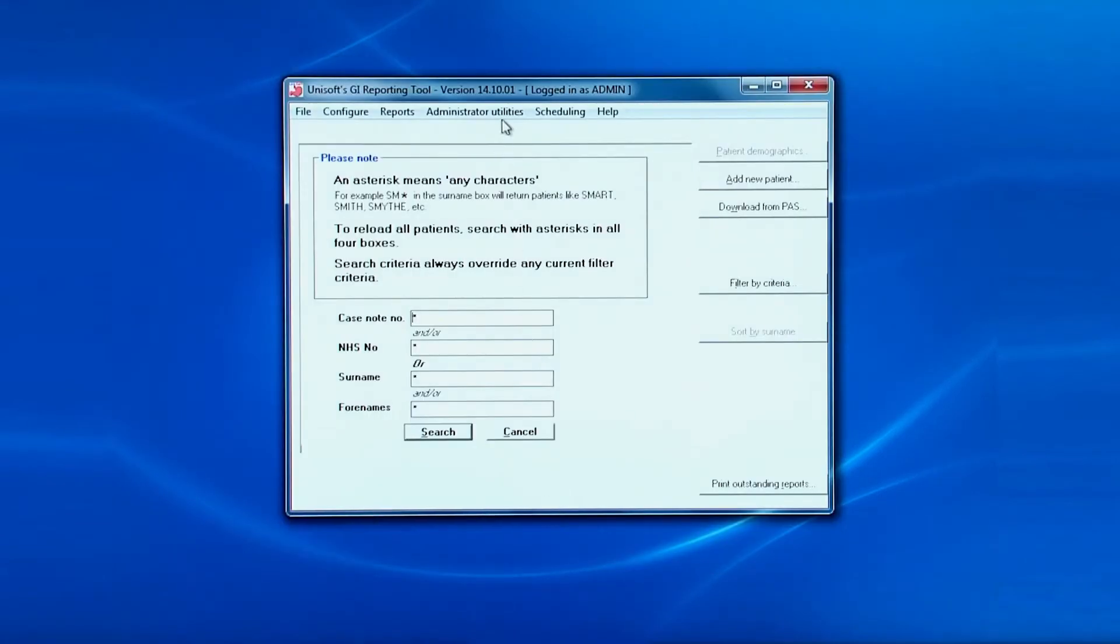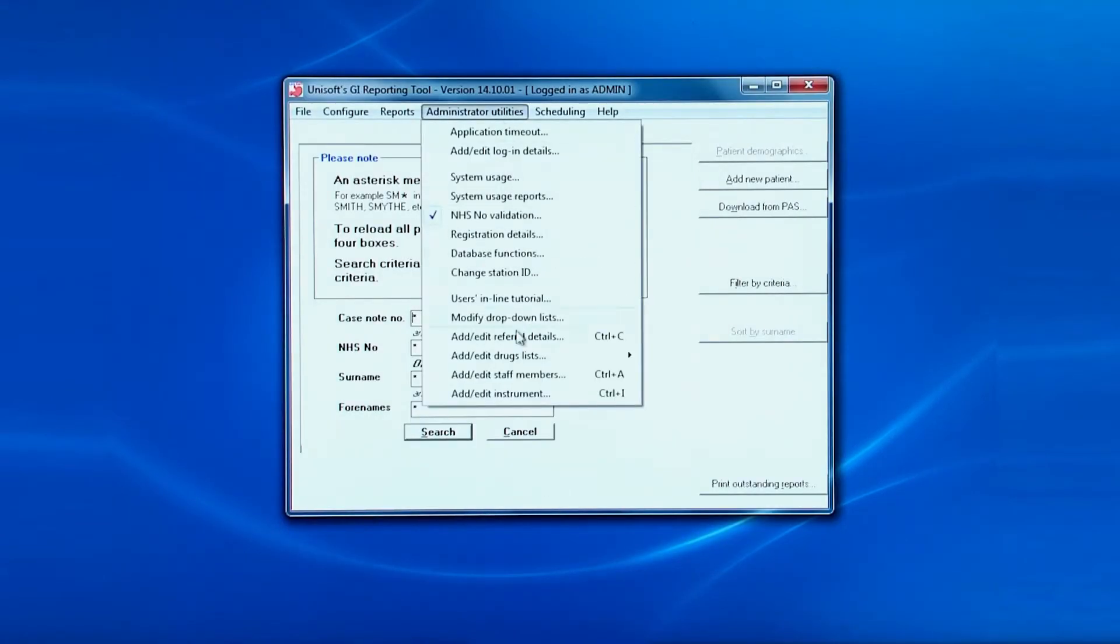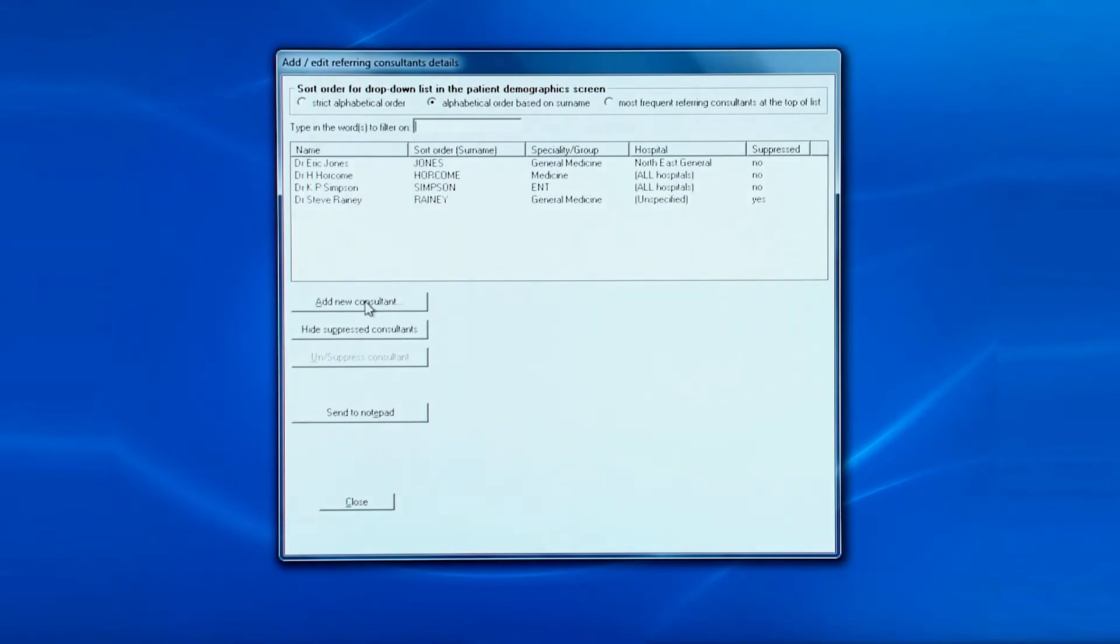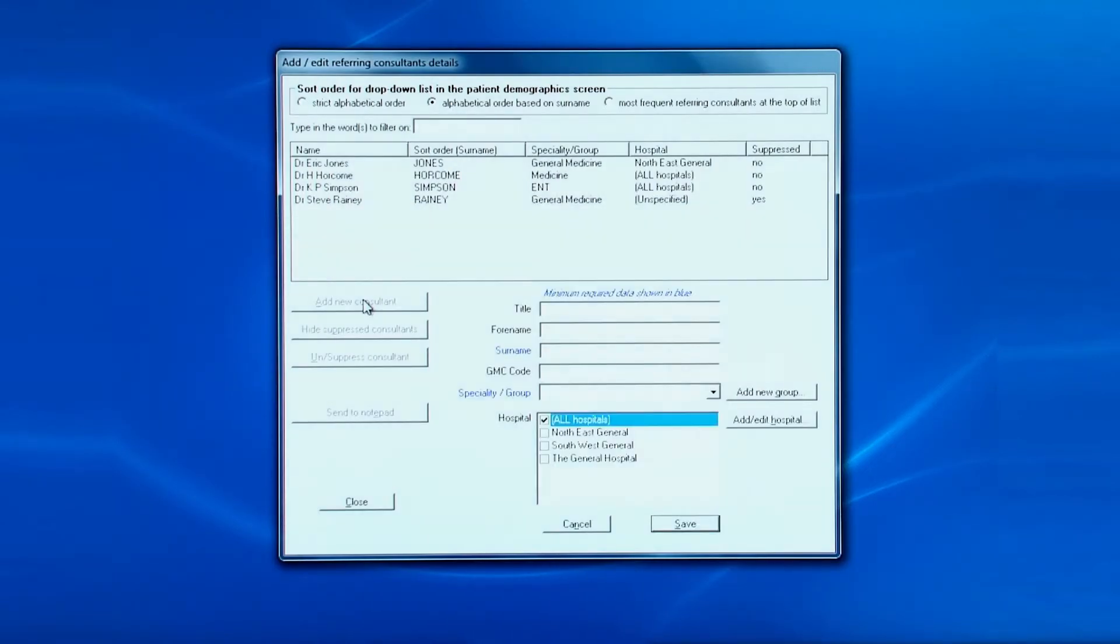If you want to add a generic referring consultant called GP, then this is what you need to do. You click add new consultant and type GP in the surname field.